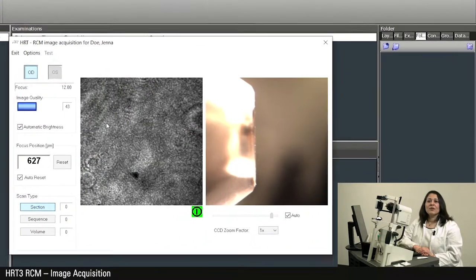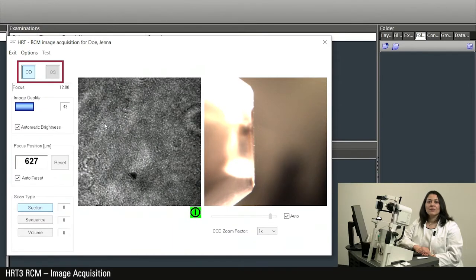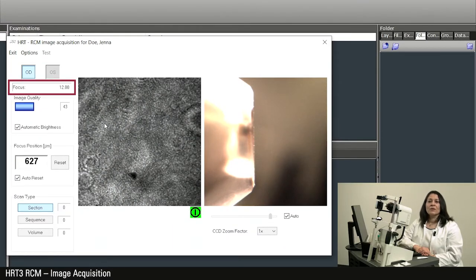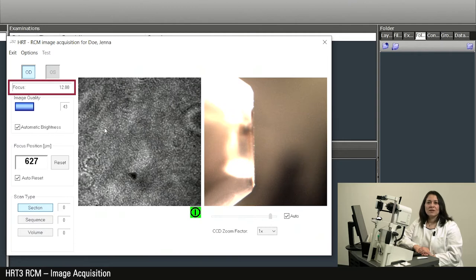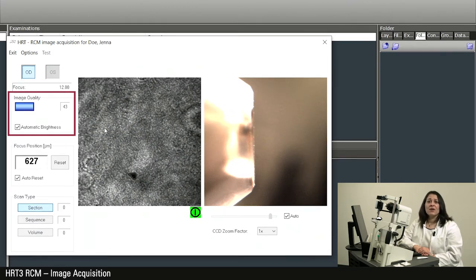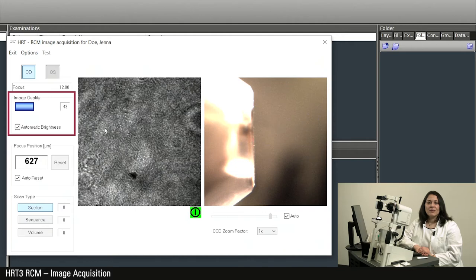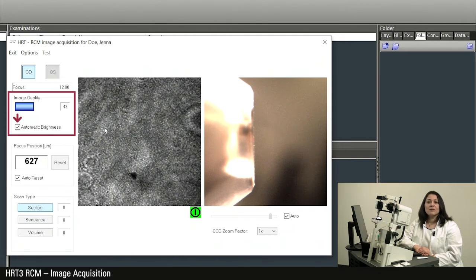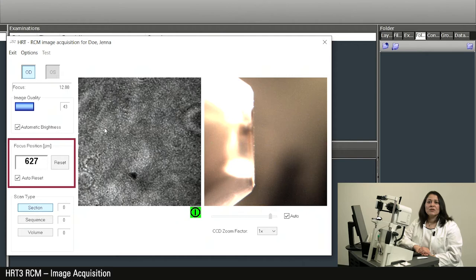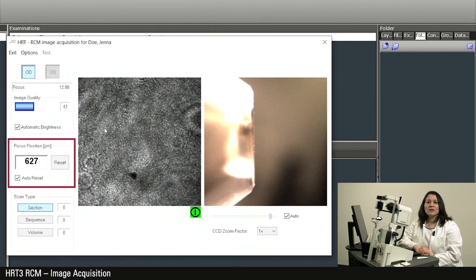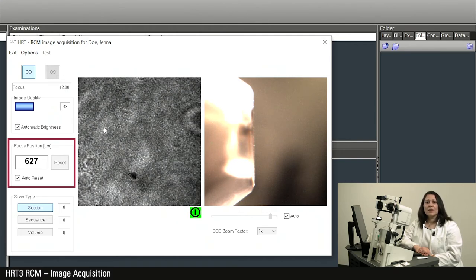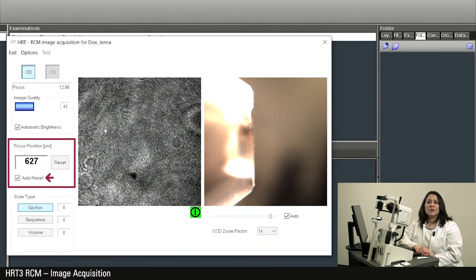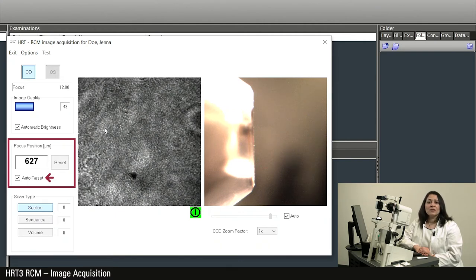The detection of the right or left eye is done automatically. Under the focus setting you can check whether the required plus 12 diopters is set. The image quality should be at least 65 for a good acquisition. An activated automatic brightness is recommended. Under focus position, assuming correct reset to the corneal surface, the depth of the current acquisition can be read. An activated auto reset sets the focus position to zero with the first acquisition.